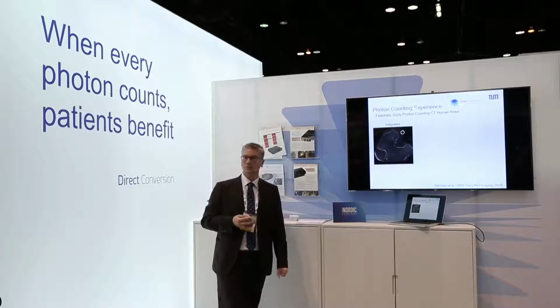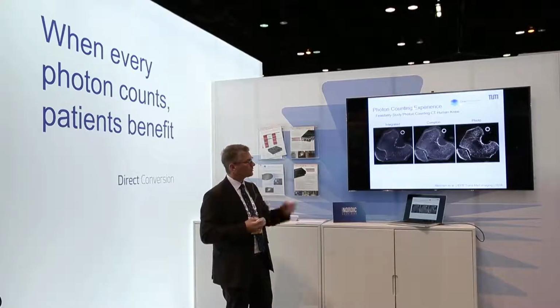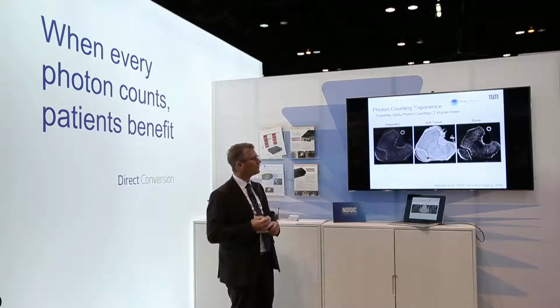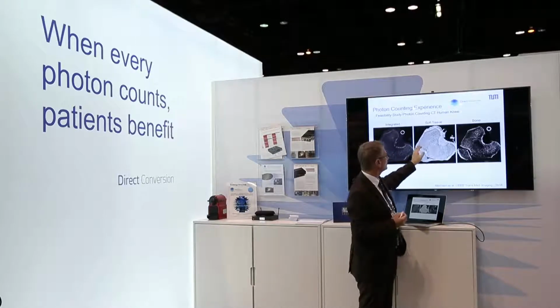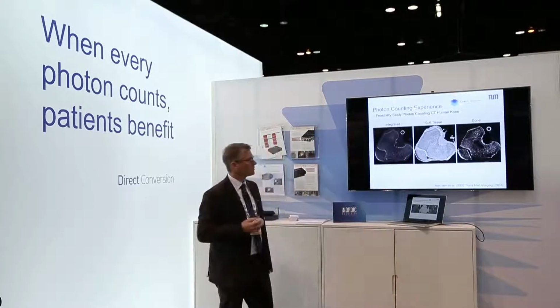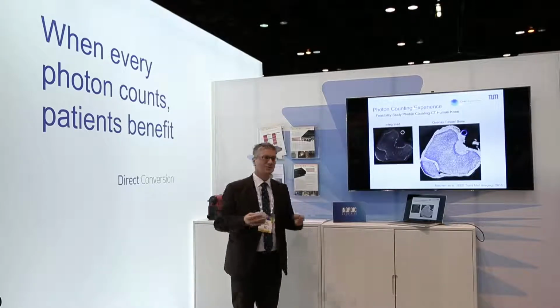This is a human knee, also ex vivo. The integrated scan, we do the whole procedure, Compton, photo effect, discrimination, separation, we convert that to soft tissue and bone. Now you have the pure bone mineral, or the pure bone on this right hand side, and here you see obviously that it highlights the soft tissue that is essentially around this bone, and that might be helpful for cartilage detection, and can now be creative about the overlay in one way or the other.